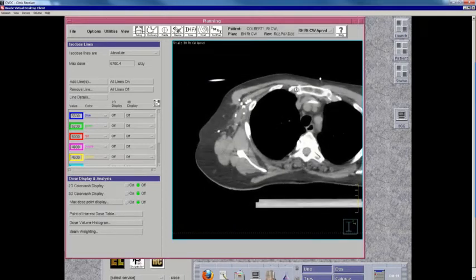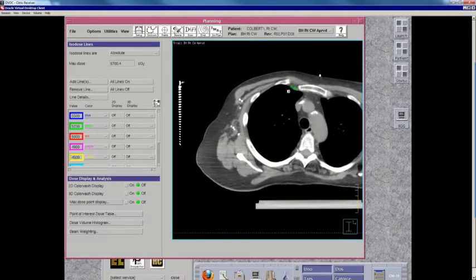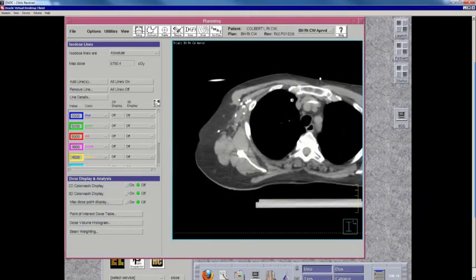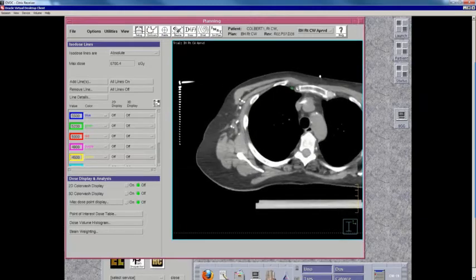And they come up here, and then they get into the space here between the sternum and the ribs. What I typically do is just contour the vessels, and then I design my field to cover the vessels with an adequate radial margin on either side. And I typically start at about the bottom of the first rib. So here's the first rib. There's the bottom of the first rib. This is where I started my contour.